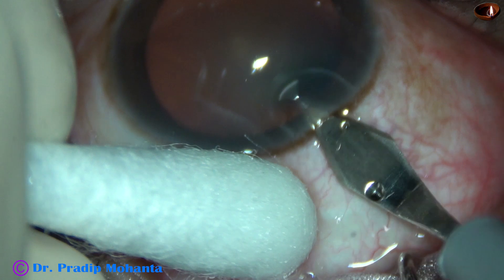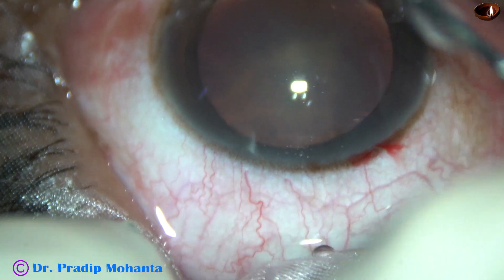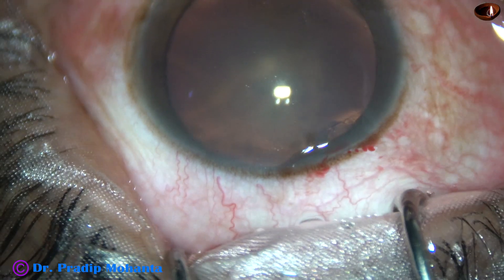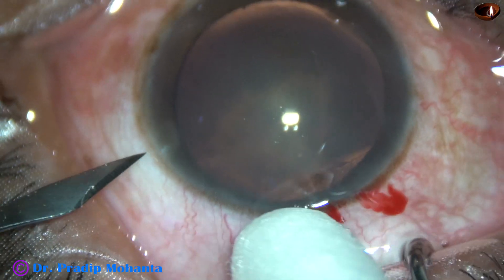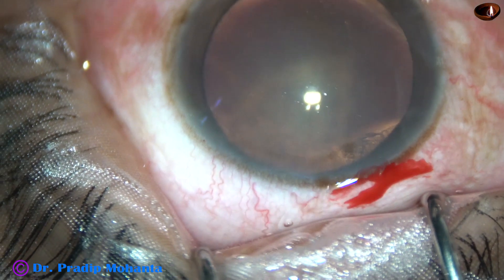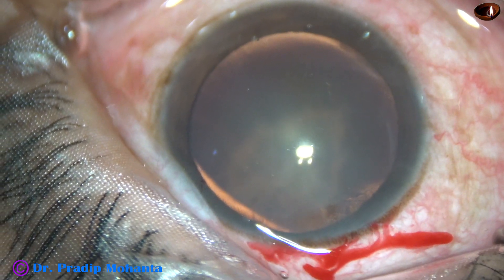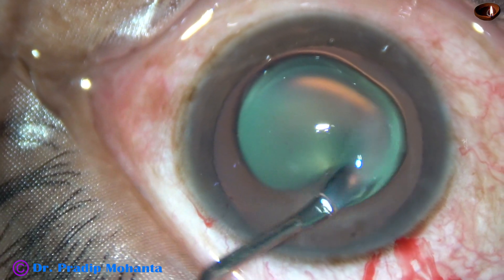This is the main incision with a 2.8 mm steel keratome. You can see this is a posterior subcapsular cataract with very soft nucleus. The anterior chamber is filled up with 2% hydroxypropylmethylcellulose. And now a side port is made on the left side of the main incision, about 2.5 clock hours away. Some more visco is applied over the ocular surface and over the corneal epithelium for better visibility.